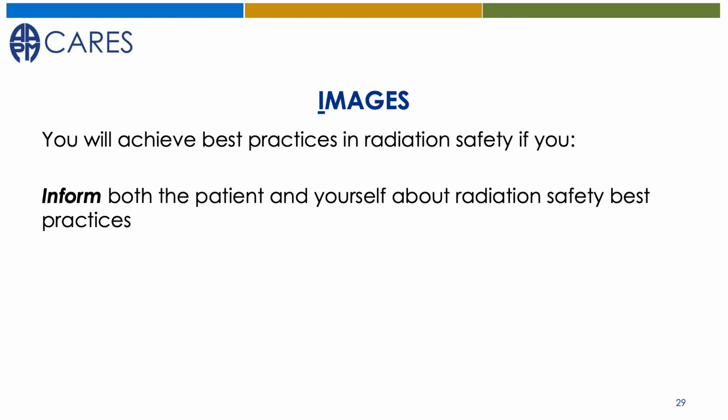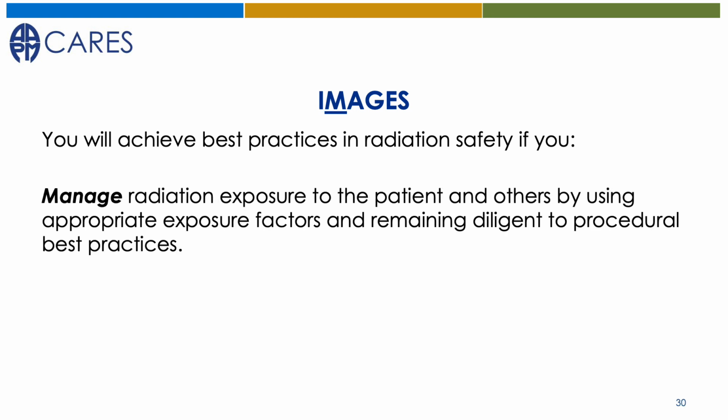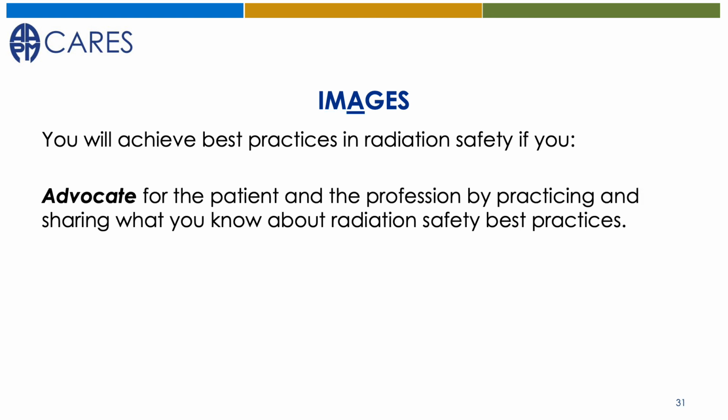So, in summary, I stands for inform. Inform both the patient and yourself about radiation safety best practices. M stands for manage. Manage radiation exposure to the patient and others by using appropriate exposure factors and remaining diligent to procedural best practices. A stands for advocate. Advocate for the patient and the profession by practicing and sharing what you know about radiation safety best practices.